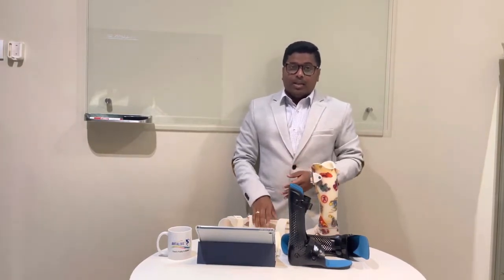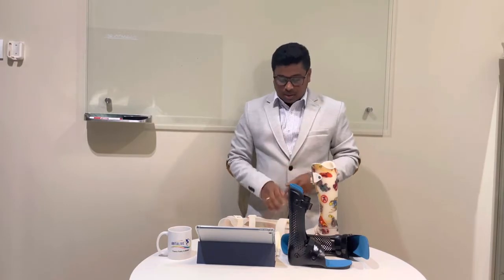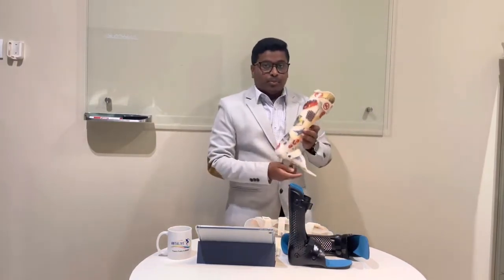Children who need an AFO are basically those who suffer from cerebral palsy, spina bifida, muscular dystrophy, club foot, and any ankle and foot deformities. There are different types of AFO available, and I'm going to show you the options. The first option is the polypropylene AFO — the plastic AFO.